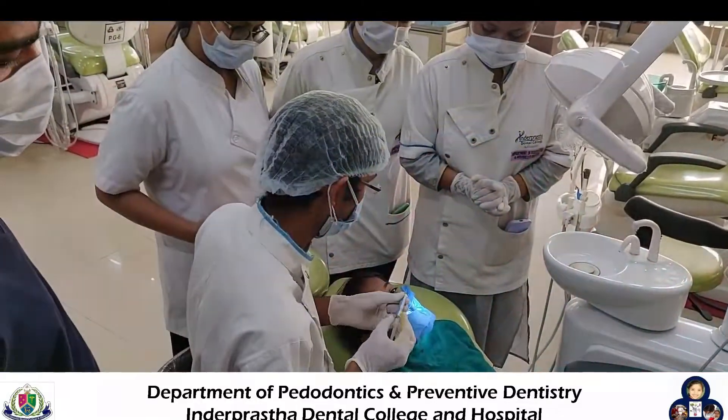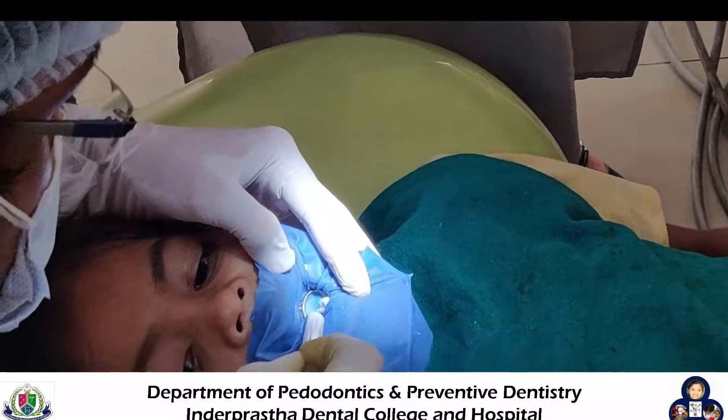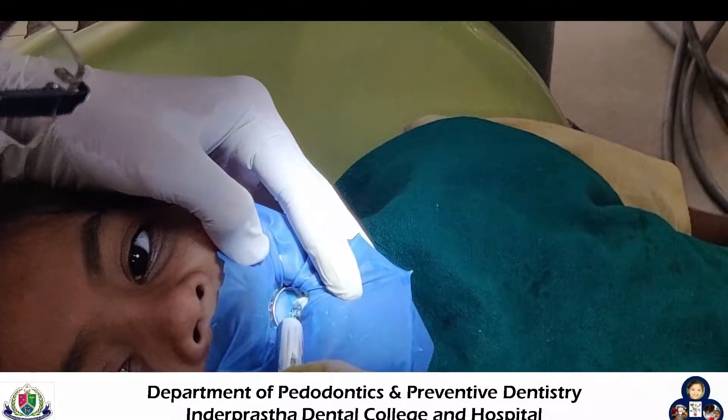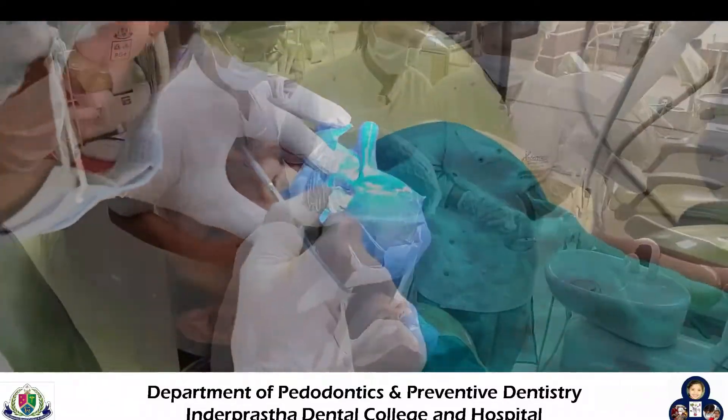After this, the agent is placed over the enamel of the prepared cavity. After 30 seconds, the applied agent is washed off and we dry the surface of the cavity.